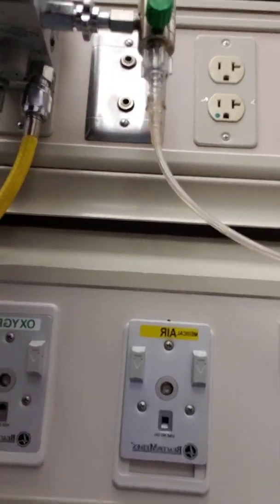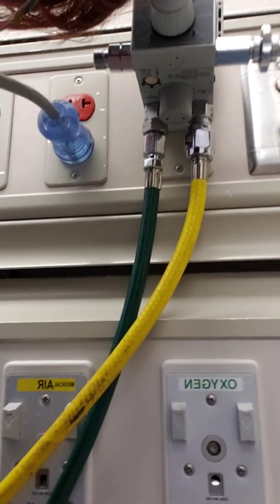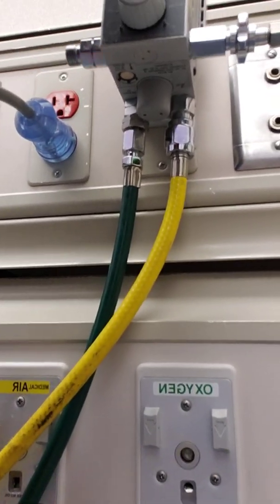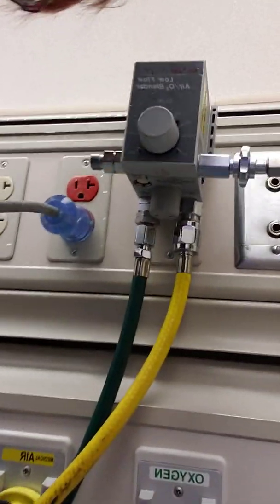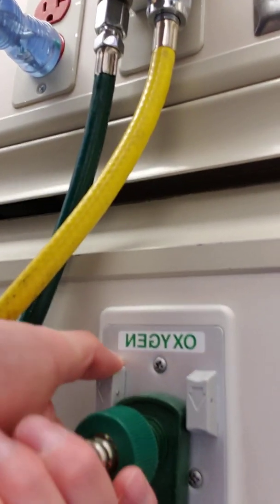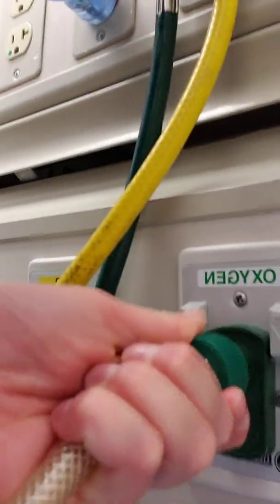And then down here we have our oxygen and air. They are marked, so oxygen, air. And these are wall connectors that hook up to 50 psi of air and oxygen, so that we can get adequate flow to run our ventilator. So we hook it in, you just push hard. Sorry, I dropped my oxygen. And push hard. To release, you'll either have a button up top, or this one you push down, and it releases from the wall. Now let's get you back to where we're holding still.